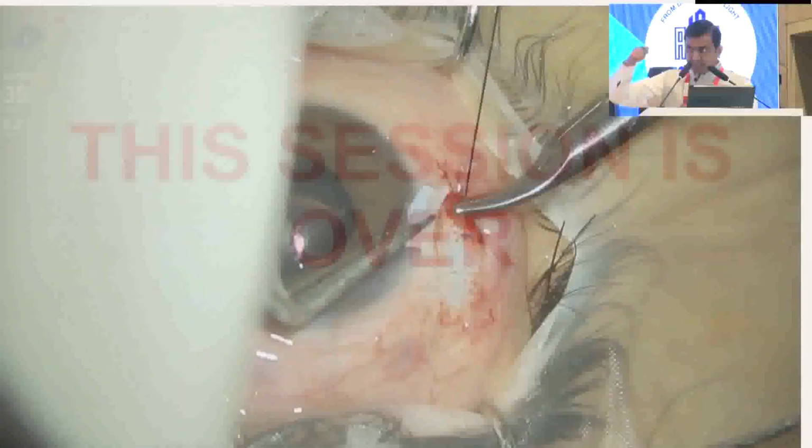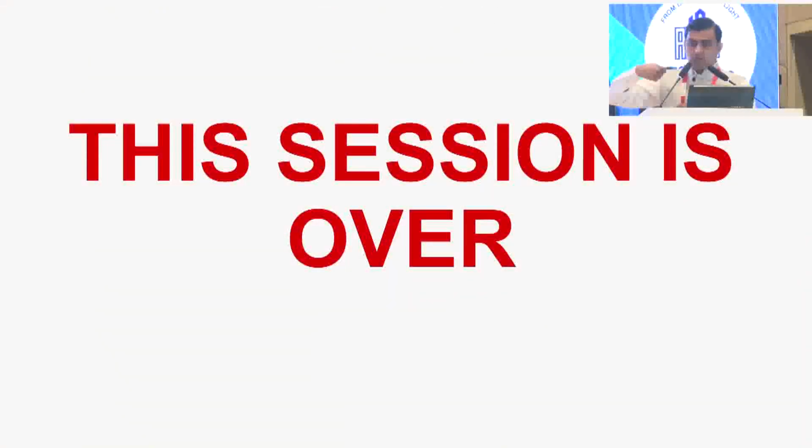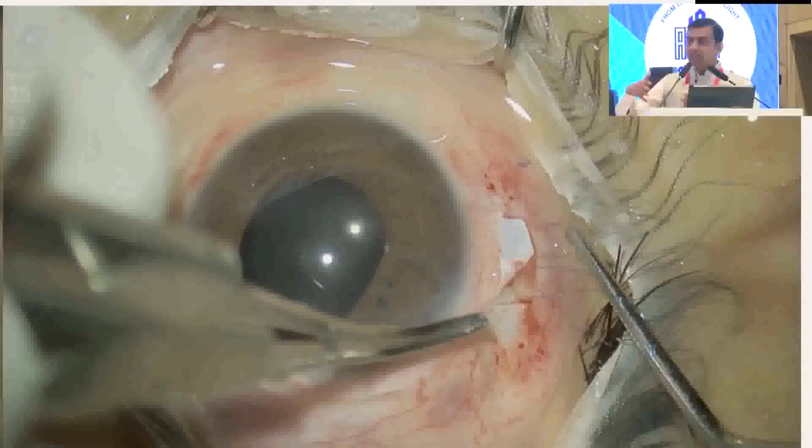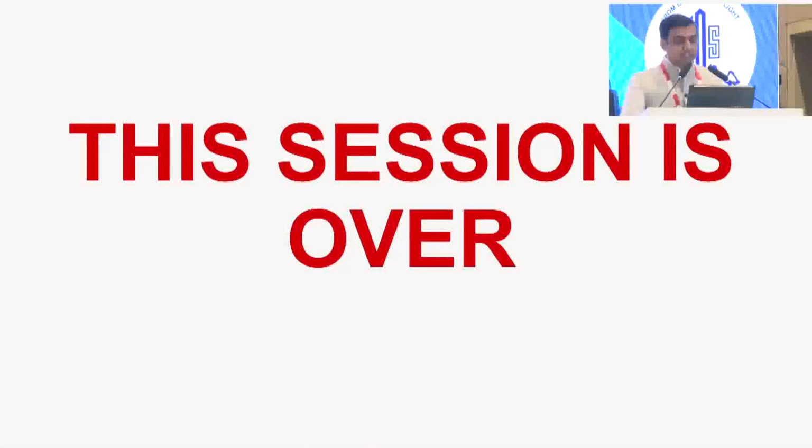So taking a stay suture to make sure that it is placed, then you cut the previous knot. Once you cut that previous knot, then just tie the knot. This procedure gets over within 10 minutes. So this is how we can refixate it.